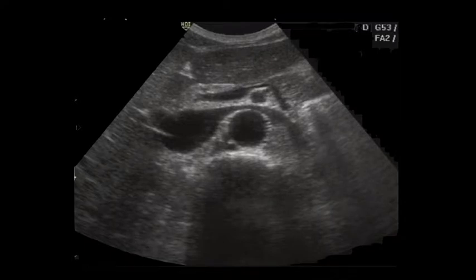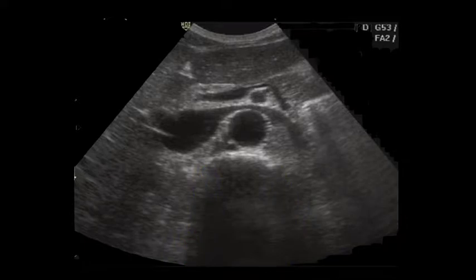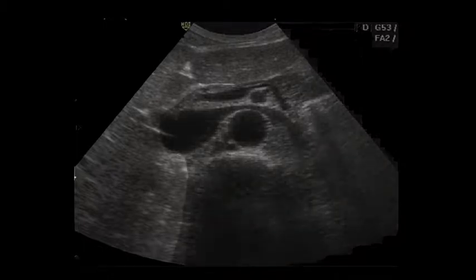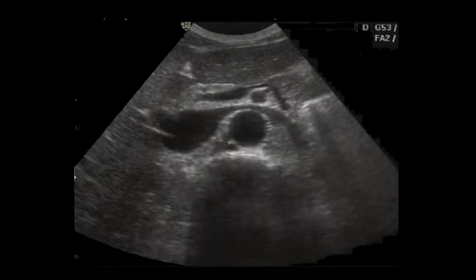Here's another example — this is the aorta in cross-section of the abdomen, just like a CT scan. I call this relative anatomy or relationship anatomy. The things that are very easy to see — what is the most posterior structure on this ultrasound? The spine. It's very easy to see because it's bright and has shadow behind it. We use the spine to tell us how deep we need to go — if you're looking in the abdomen, there's nothing posterior to the spine we can image. Then the largest organ in the abdomen is the liver.